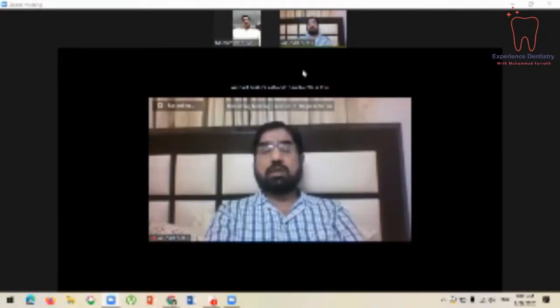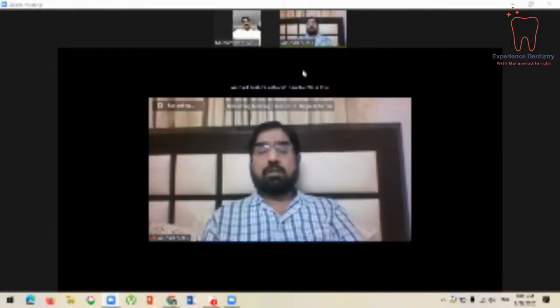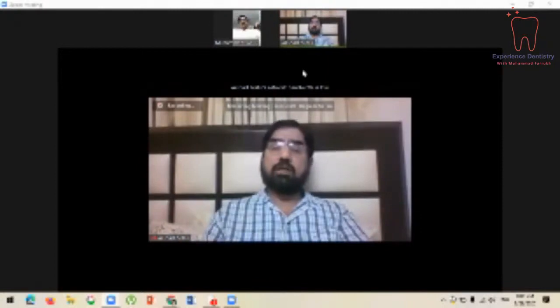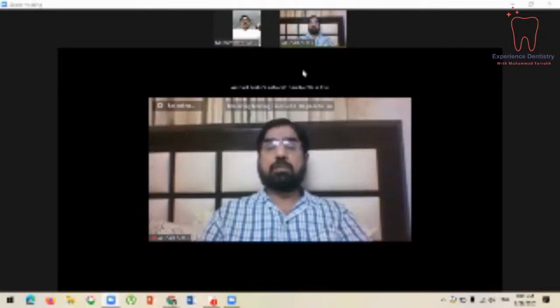This slide I made approximately 5-10 years back when I was in Dima Mercy College of Dentistry, and a few of them were taken from one of my colleagues. These slides are older. Now the dot placement is not so mandatory, and with the X-ray films, whether the dot is above or down, it doesn't matter at all.